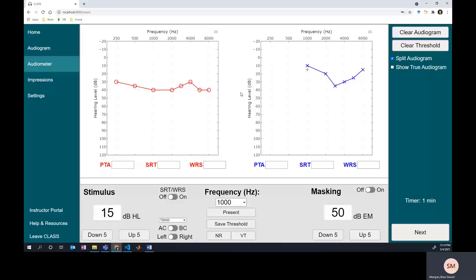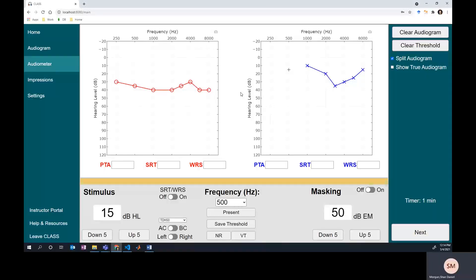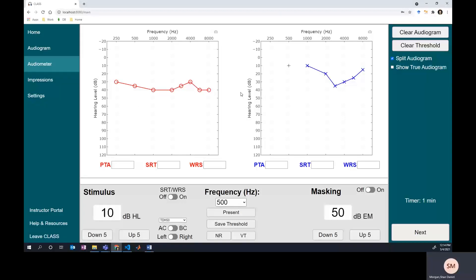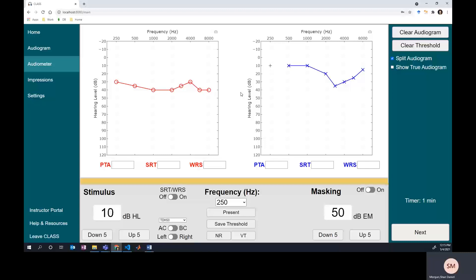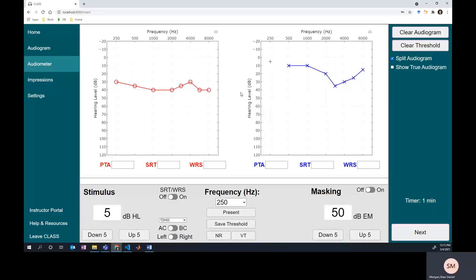And then an interesting one — it looks like there's a noise notch in the left ear. The right ear looks like a kind of flat odd loss. I'll have to check for masking when I'm done with all the air conduction thresholds. So this is where we're at right now: we've got our air conduction unmasked thresholds. It looks like we've got a noise notch looking loss in the left ear and a flat mild hearing loss in the right ear.